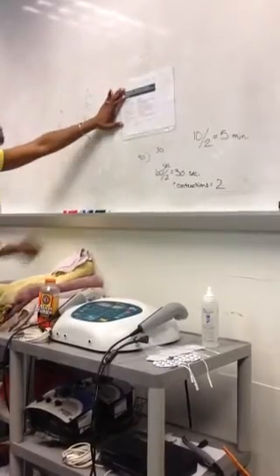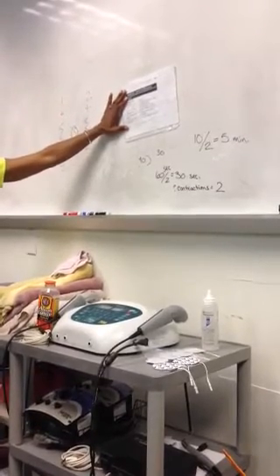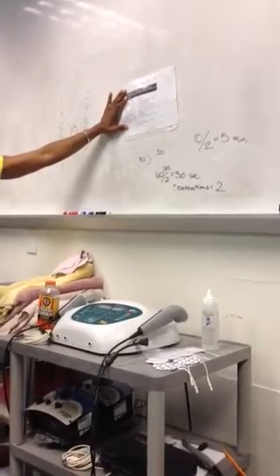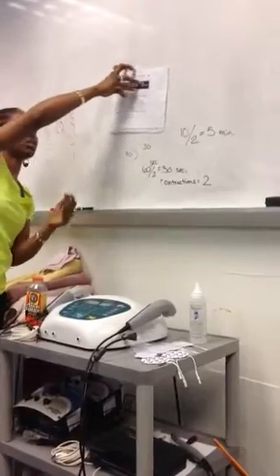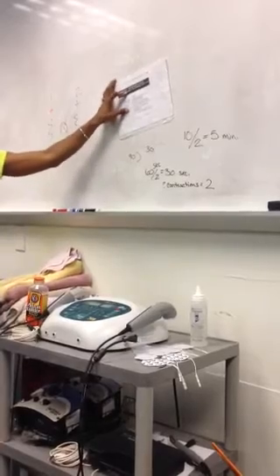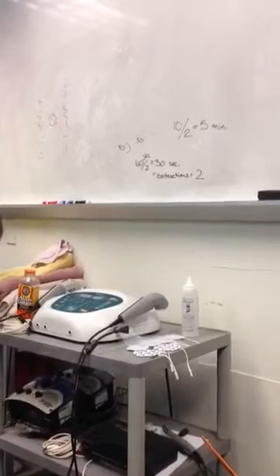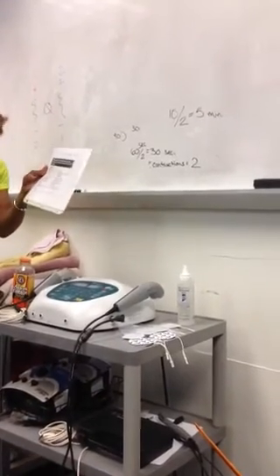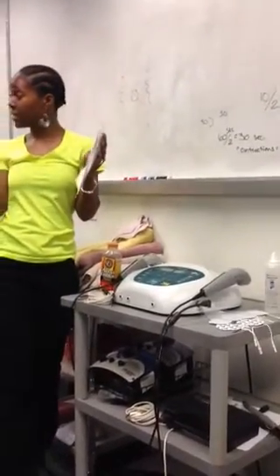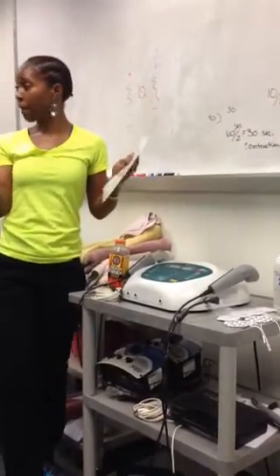So for our Marine, our dedicated serviceman with that labral tear, when we're trying to work on his scar tissue, right about week 2, 3-ish, 4, depending on the patient, we're probably going to use the vigorous setting. Why? Because we're increasing range of motion, we're increasing tissue extensibility, okay? So that's our vigorous setting. So mild, target temperature is 1 degree Celsius. Moderate, target temperature is 2 to 3 degrees Celsius. Vigorous setting, target temperature is 4 degrees Celsius, or 3 to 4. Cool?